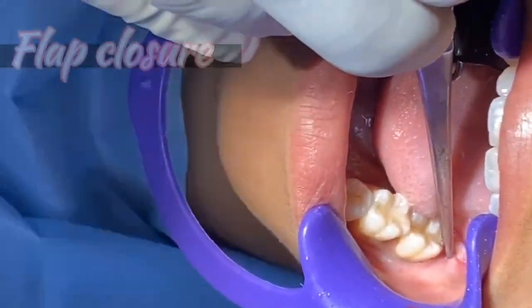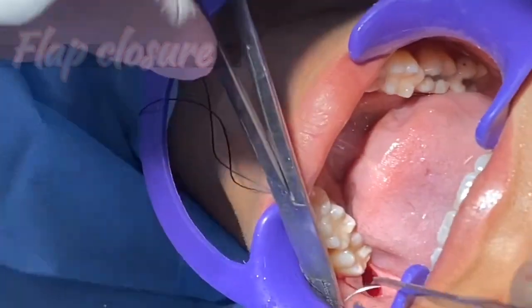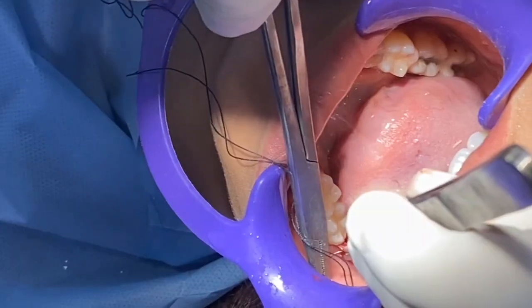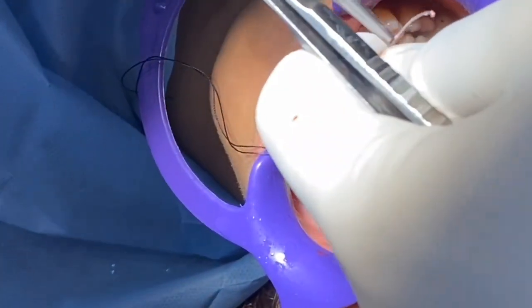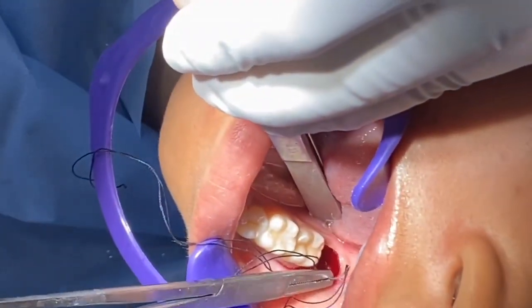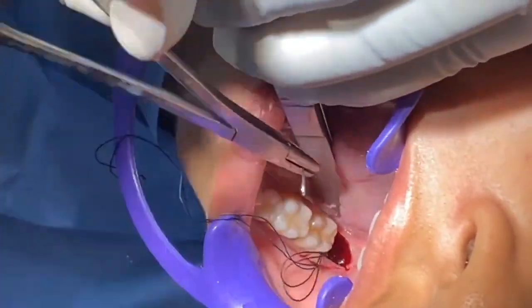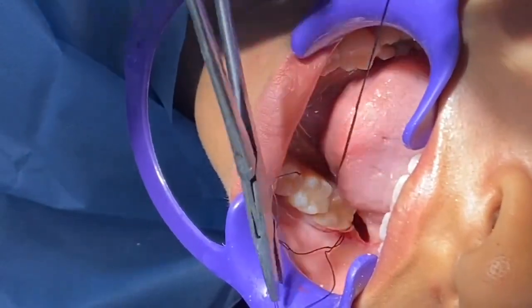Next is we are closing the flap back. An even part of the flap has to be pushed onto that area. Take a part of the tissue and that has to come around the lingual side. On the lingual side, you turn it around so that the flap can come around and prevent pocket formation at all.